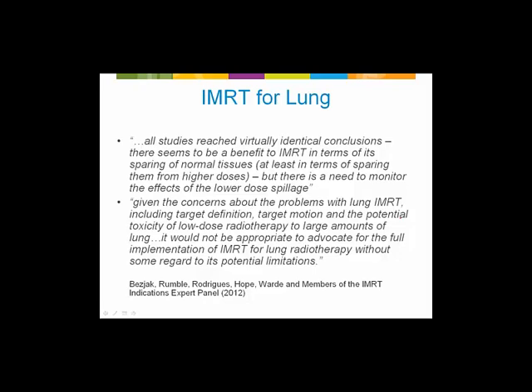Now, they also said that given the problems with lung IMRT, including target definition, target motion, and the potential toxicity of low-dose radiotherapy to large amounts of lung, it would not be appropriate to advocate for the full implementation of IMRT for lung radiotherapy without some regard to its potential limitations. And this is pretty recent stuff that we're talking about, okay?